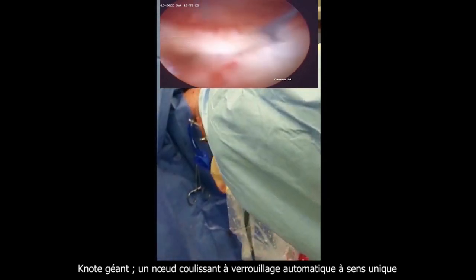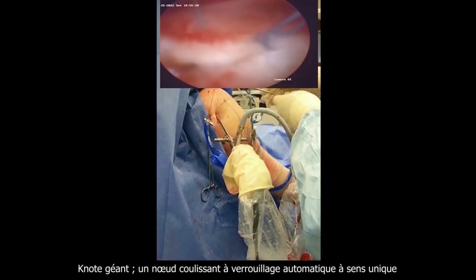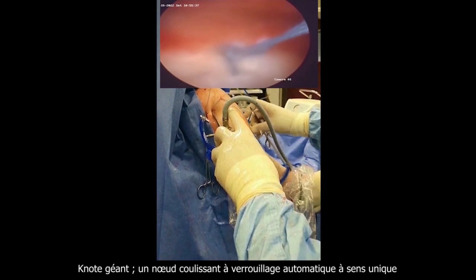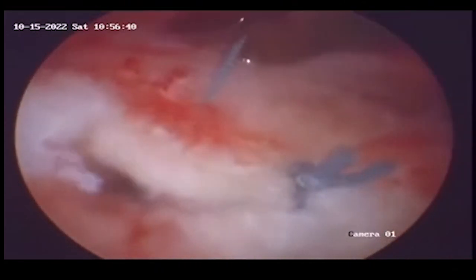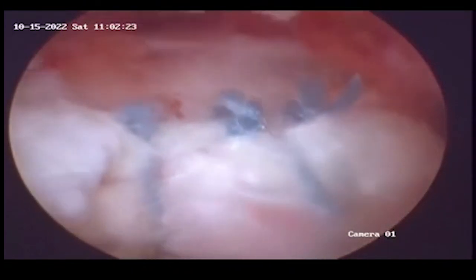In order to secure the knot, we pull the loop. Here you see it is now blocked by a quick pull on the loop. After that, we cut the rest of the suture, and the same thing will be done to the second suture. Here with the ring forceps, we will pull the upper end of the suture through the instrumentation portal, and here after putting 3 sutures in the repair and fixing the repair completely to the footprint area.